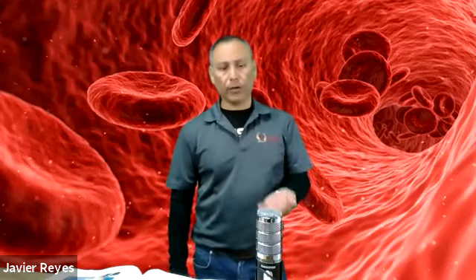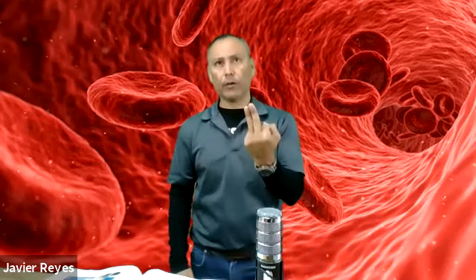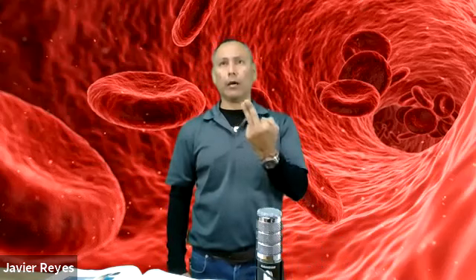You're going to be looking at the third and fourth fingers, right? One, two, three, and four. So these are the two fingers that you're going to be performing a capillary puncture on in children 1 year or older or in adults. Infants 0 to 1 will be done with the heel puncture. The young child is usually held in a lap by the parent or guardian, and the infant will usually be in a bassinet or in a crib where you can perform this.